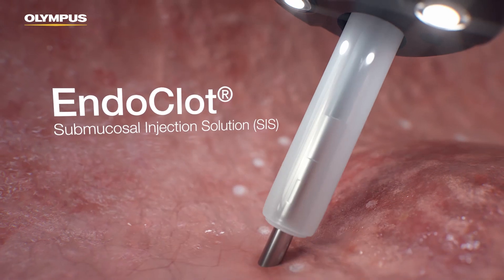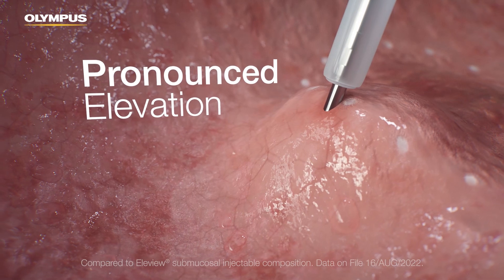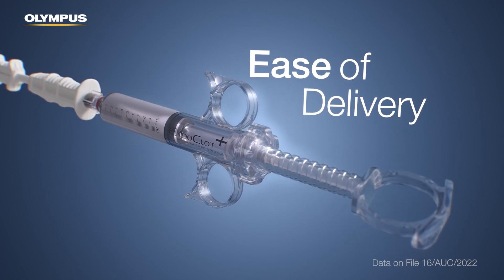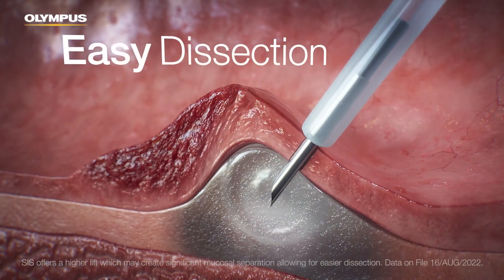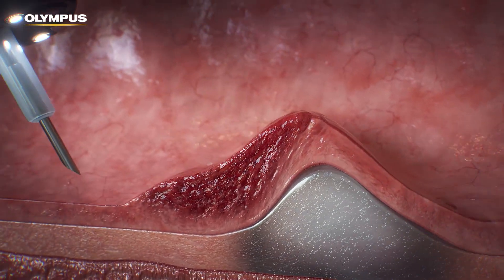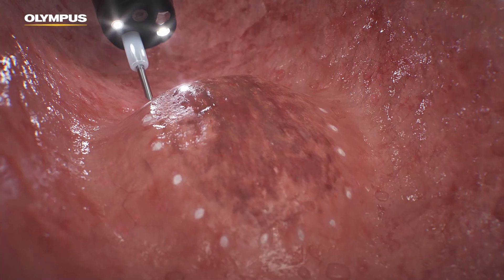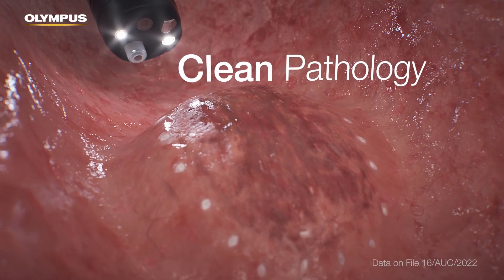EndoClot SIS offers longer and higher lift compared to Elevue submucosal injectable composition. With a specifically designed spiral syringe, EndoClot SIS is intended to be delivered to the targeted area accurately. It is designed to offer a high lift, which may create mucosal separation. It uses the same proprietary absorbable modified polymer, AMP, particles as the EndoClot PHS.